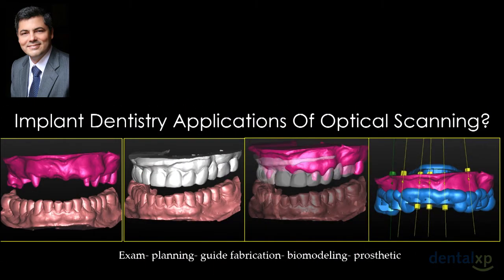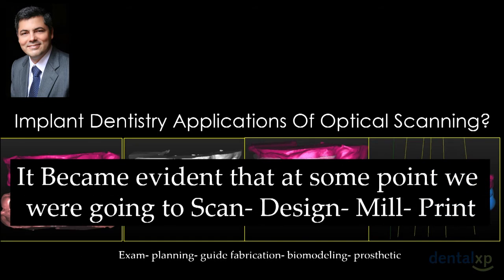We can examine our patient digitally utilizing this type of scanning process. We can plan our work. We can guide the fabrication of any type of device. We can create biomodels utilizing these models. And we can also make our prosthetic work utilizing, again, optical scanning. So optical scanning has completely redefined dentistry, and it's nothing that would bite you. It's something that you have to sit down for a while and try to understand the process from A to Z to be able to make it happen in your practice.